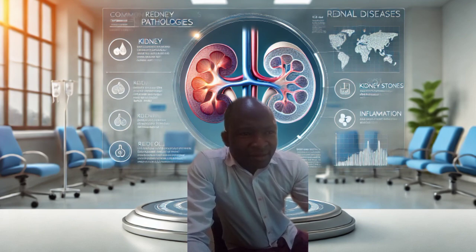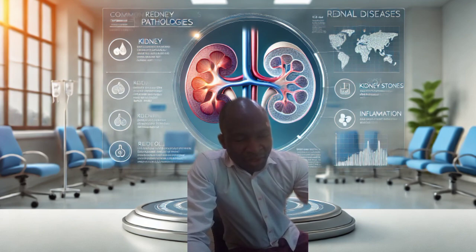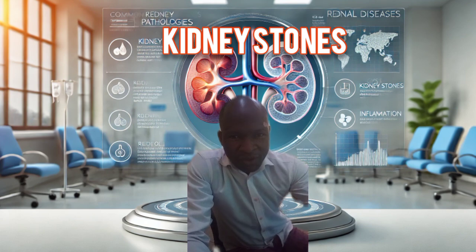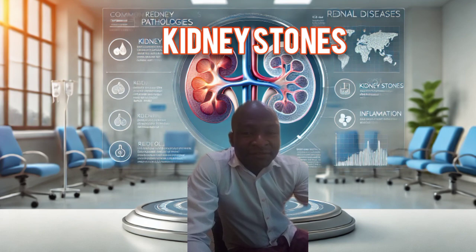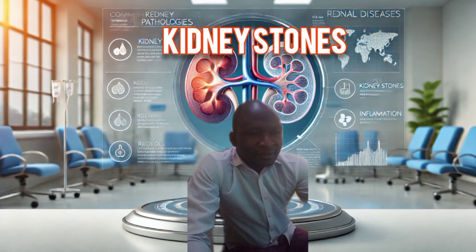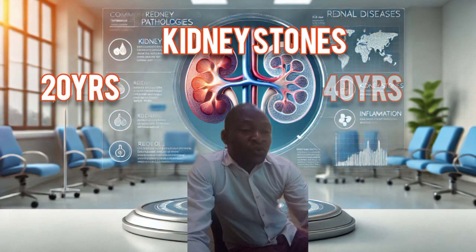Today we'll look at renal pathologies, the common renal pathologies. We'll begin with renal calculus or renal stone, otherwise called urolithiasis or nephrolithiasis. Renal stone or urolithiasis is most common in men from age 20 to 40.